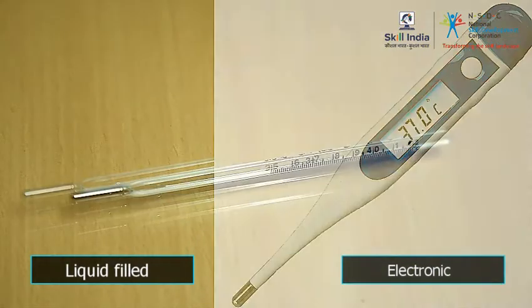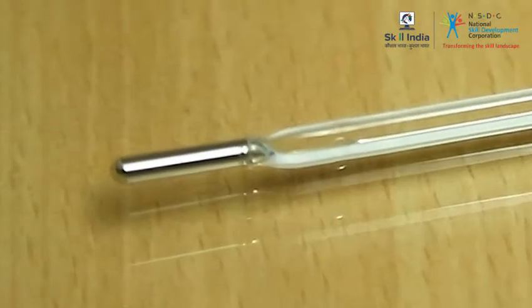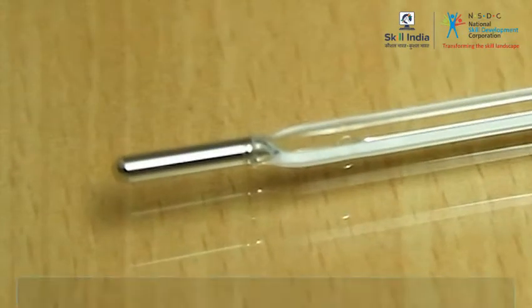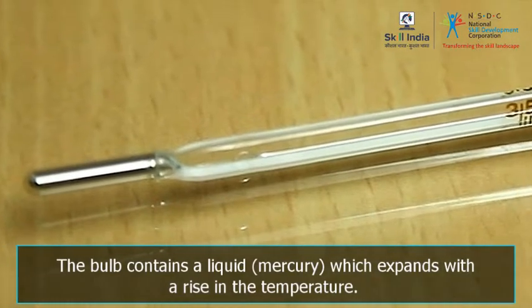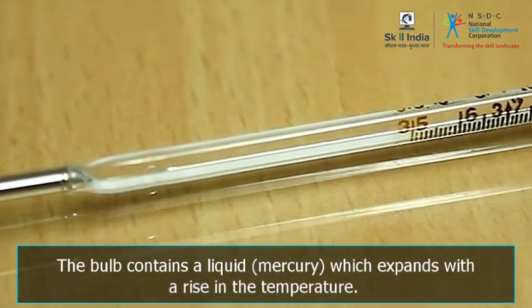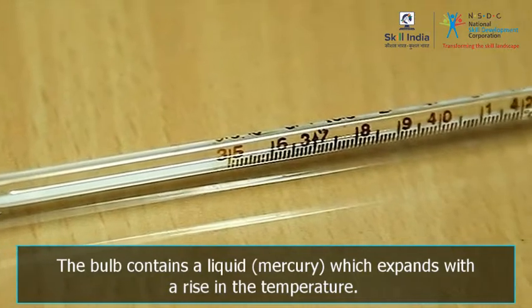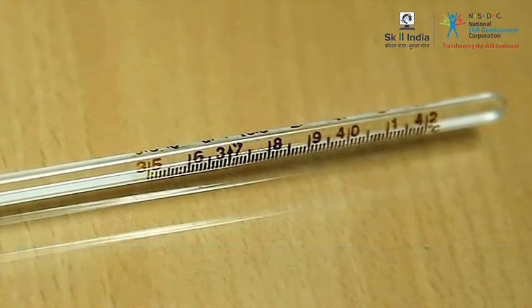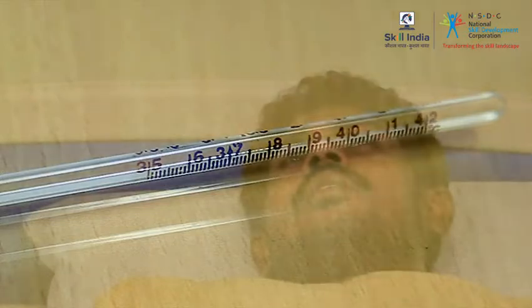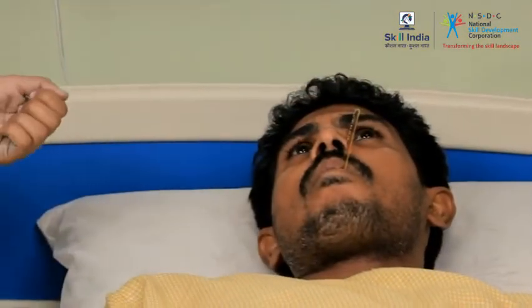The traditional thermometer is a glass tube with a bulb at one end. The bulb contains a liquid, which is often mercury. The liquid expands with a rise in temperature. The glass wall of the thermometer has calibrated marks that indicate the temperature levels. The bulb of the thermometer is inserted into a body part to measure the temperature.